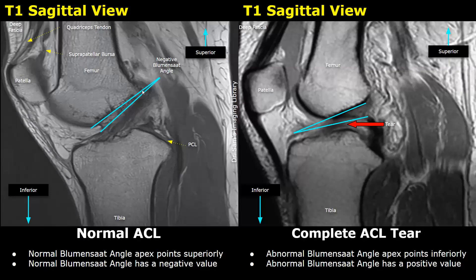Any angle formed in the normal case will have a negative value. But in cases of ACL tears, the Blumensat angle will be formed down here, facing inferiorly. When we draw the Blumensat line and the second line along the margins of the ACL, the lines will meet at this point with the apex facing downwards — a positive value. A positive Blumensat angle is seen in ACL tears.